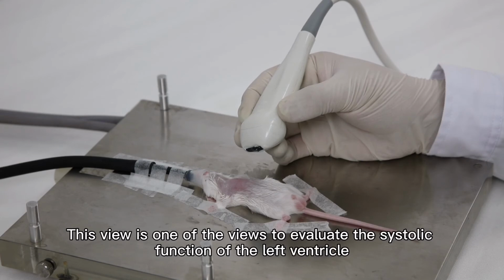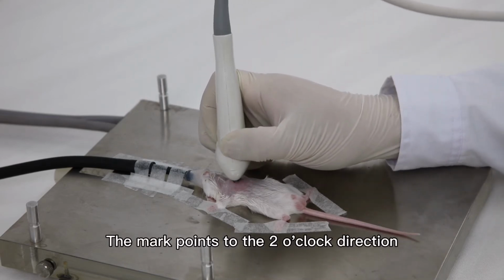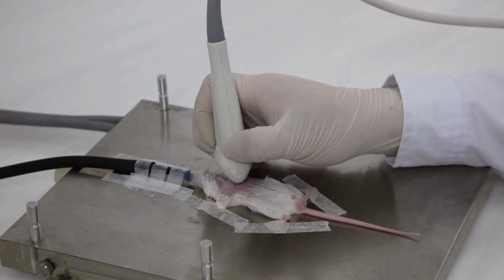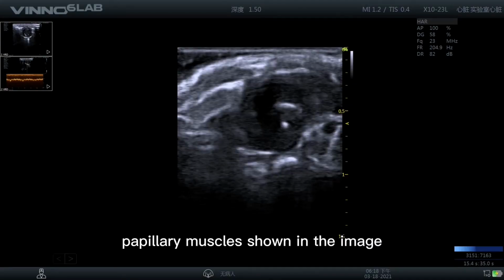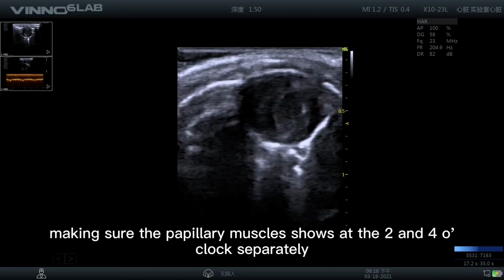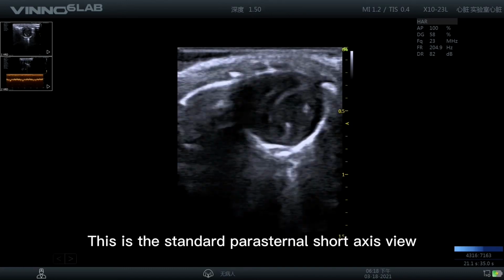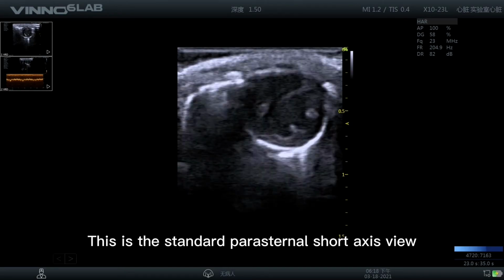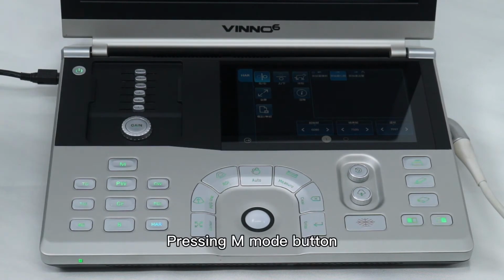Parasternal short axis view. This view is one of the views to evaluate the systolic function of the left ventricle. The mark points to the 2 o'clock direction. Adjust a little bit until the left ventricle papillary muscles are shown in the image, making sure the papillary muscles show at the 2 and 4 o'clock separately. This is the standard parasternal short axis view. Press Store button. Press M mode button.